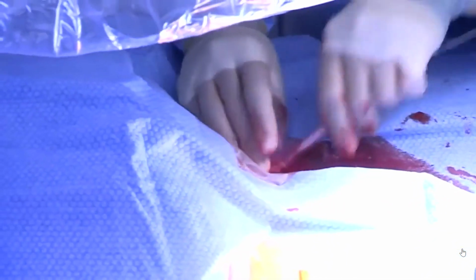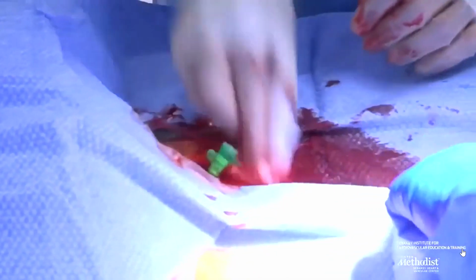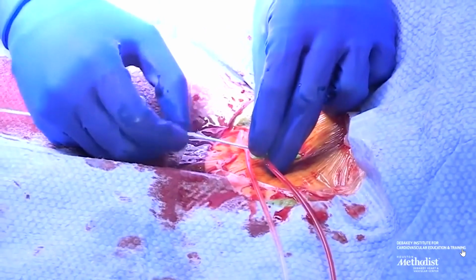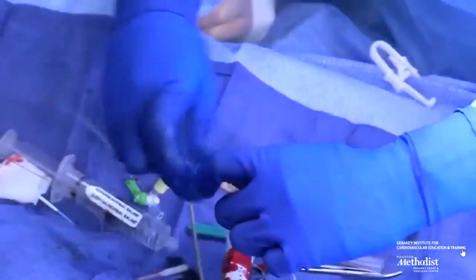Then we gain access through a Seldinger technique. We usually go for the non-sheath vessel, meaning if we're going to use the sheath on the right side, we start with the left side. We place a 6 French catheter, that's what you're looking at. And then through that 6 French catheter, after it's secured, we put a Lima catheter.